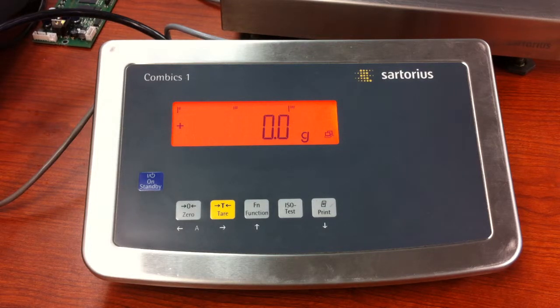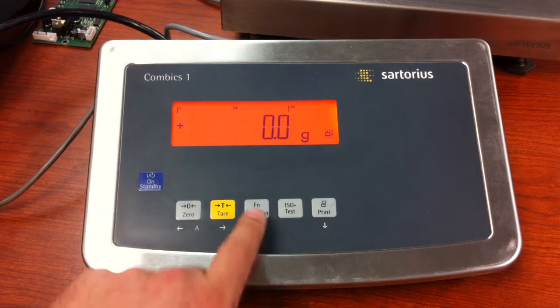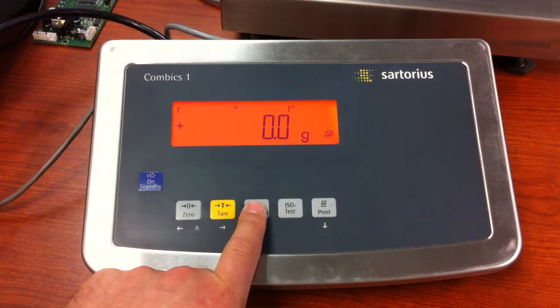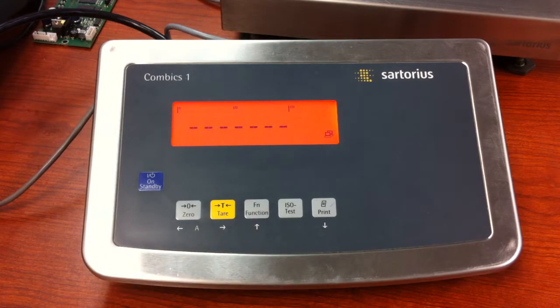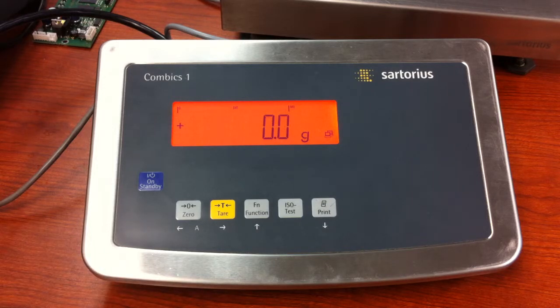This video deals with setting up the function key to give you a second unit of measure. The toggle function will be on the function key, and once we set it up, you'll be able to press and release the function key to get another unit of measure. Right now we're set up in grams, and we want to be able to press the function key and get pounds or any other unit of measure. So we need to set that up.